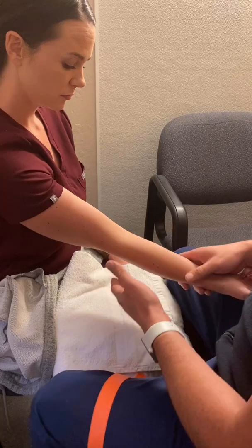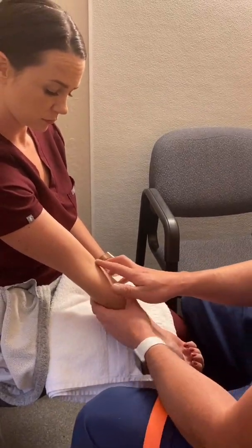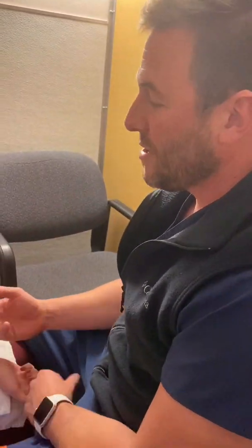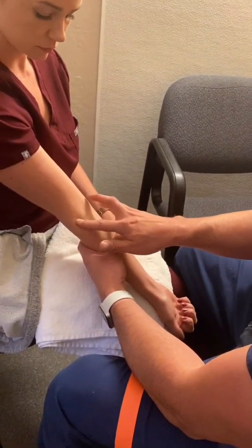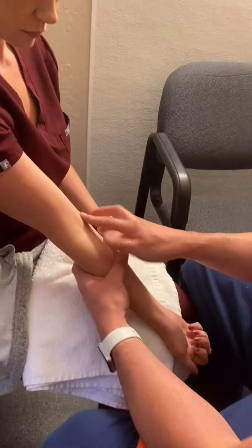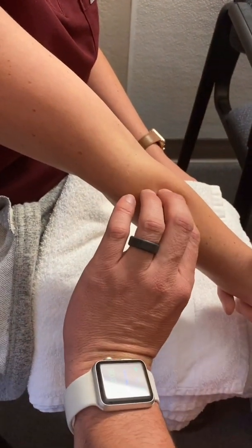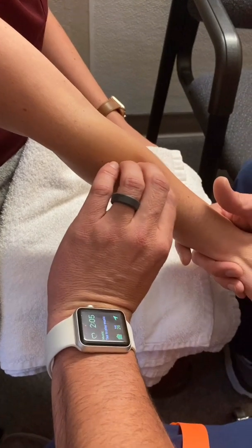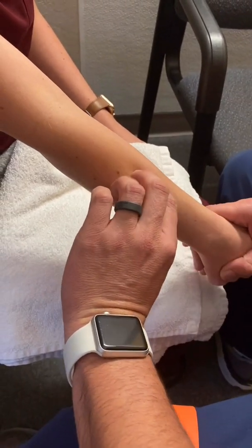When you have the tourniquet on, just for demonstration purposes, you don't have to look for a vein. We encourage you to feel. You can't always see every vein. So while you have the tourniquet on, feel for those veins. They're all around. You have your brachials, your basilic, your antecubitals, your medials, your cephalic. You have so many types of veins that you can feel, and you can't see them, but you can feel them.